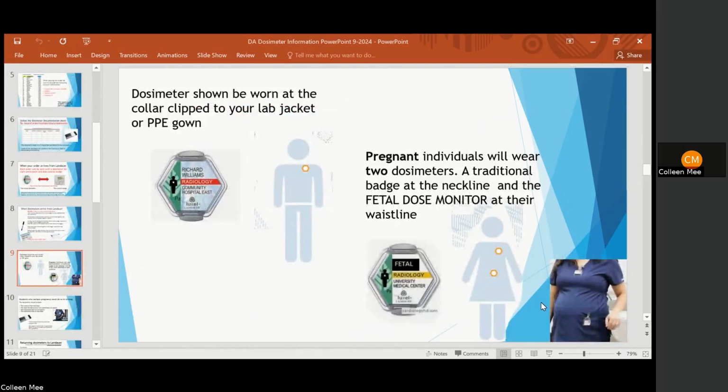If you have a student, and I know I clipped this, I moved the screen ahead, but I just want to mention, if you have a student who has dropped for some reason, their dosimeter is held until the other student, let's say, we'll go to my example, Jane Doe and John Smith. John Smith drops. He says, dental assisting is just not my thing, and he's gone. You hold on to his dosimeter and you return it with Jane Doe's because they were ordered together, they go back together. All right, now moving on to this slide.